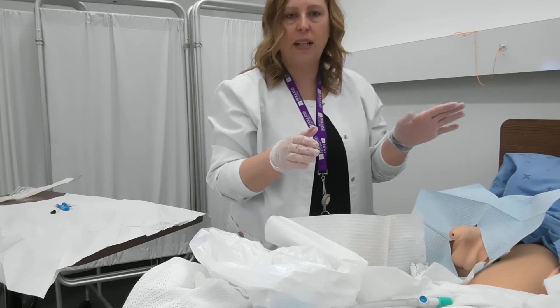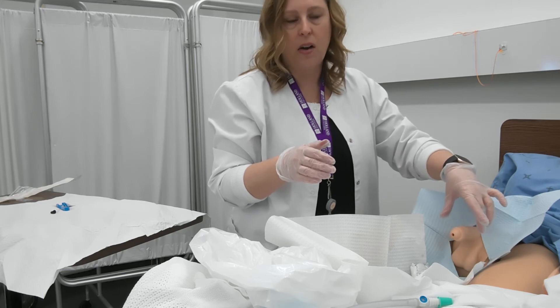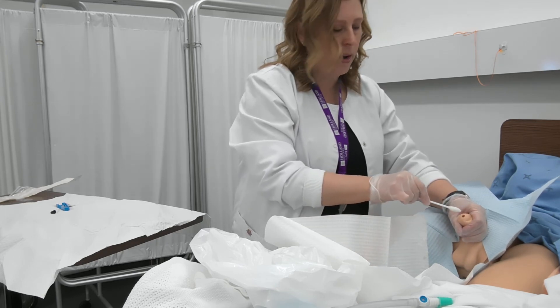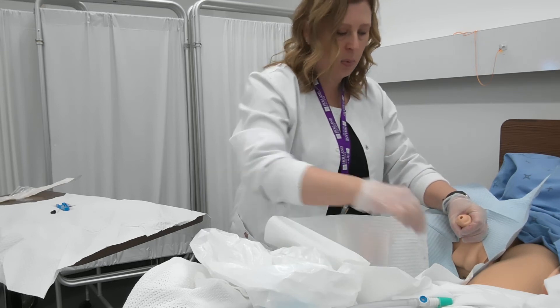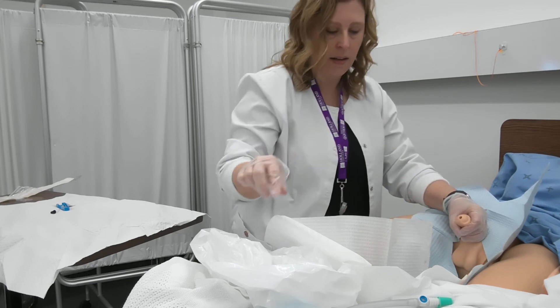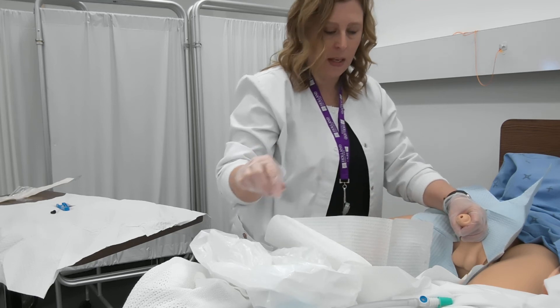I'm now going to take my non-dominant hand and grab the penis. If your client has not been circumcised, you're going to want to pull back on the foreskin. We're going to start cleaning right from the meatus and work our way out, cleaning in a circle and disposing of the swab. Repeat starting at the meatus, working your way around and dispose. Then one more time and dispose.